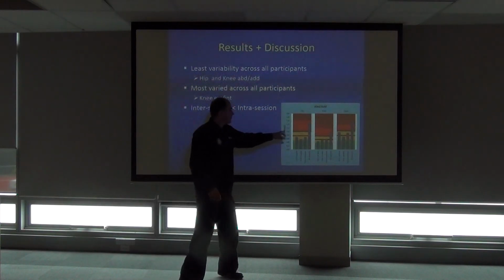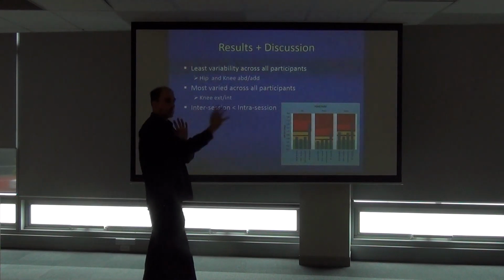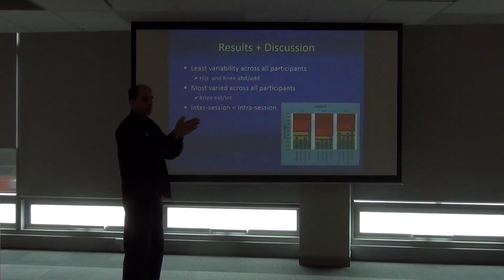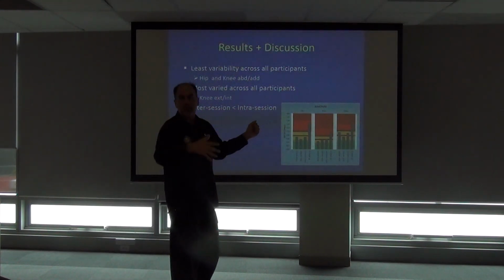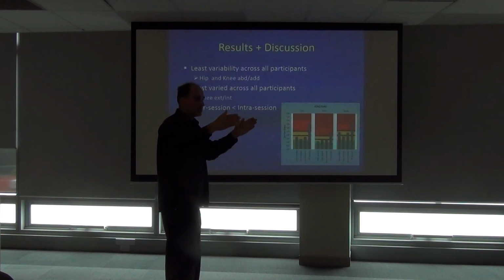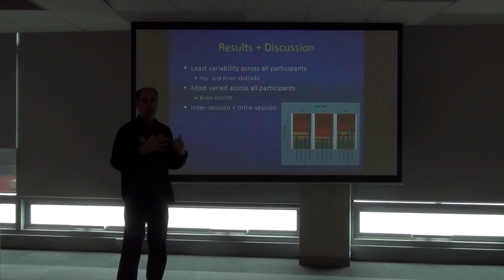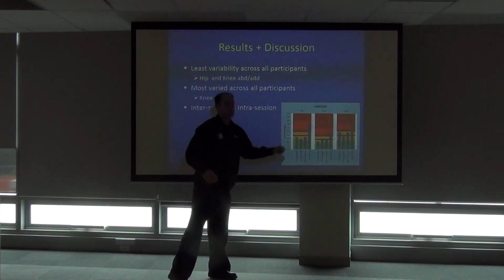But why this is better is you walk up and down, you've got individual trials. So subtle variations in speed, in step length, step width come in to produce variability walking up and down. You take the mean of that trial, okay? And then you come in another day, you've got subtle variations in walking speed and step length and step width, and so there's variability there, but then you take the mean. And now inter-session, you're comparing mean and mean on a third day. That has reduced or increased the reliability. It's reduced the variability between sessions, and that's why it's dropped.